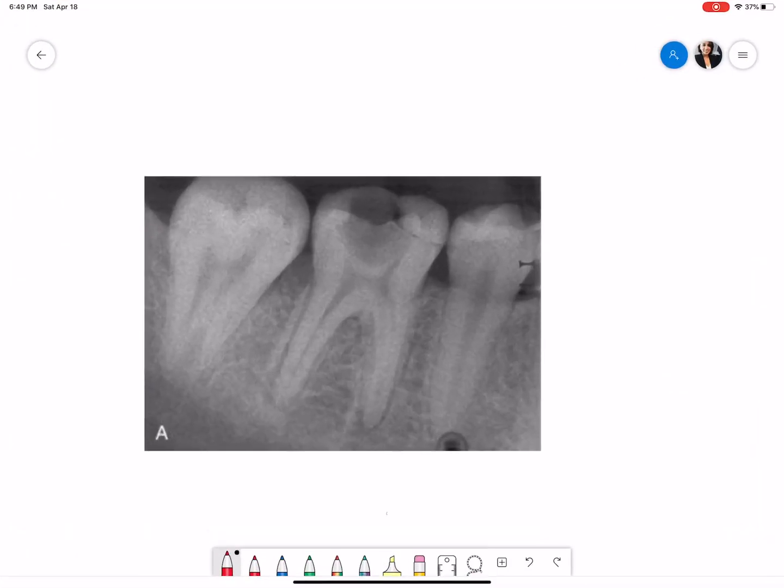Hi guys, this is Ravi Prakash talking on behalf of Karthika Noorra for the Capit Simplified. Today I'm going to show you the interpretation for an intraoral periapical radiograph taken for a mandibular posterior quadrant. Here we go. This is an intraoral periapical radiograph taken for right mandibular posterior quadrant.